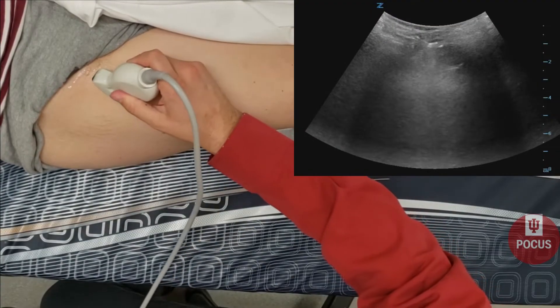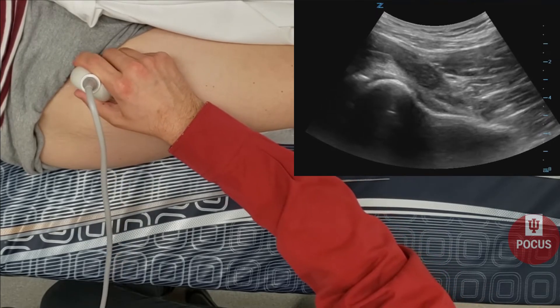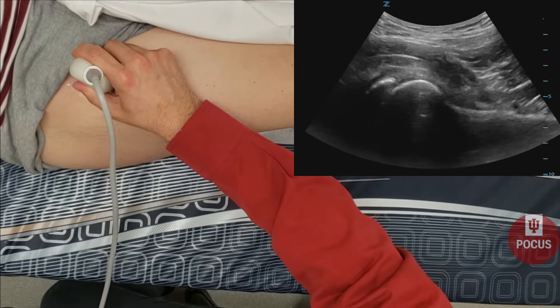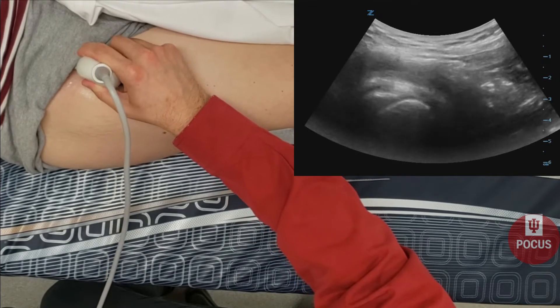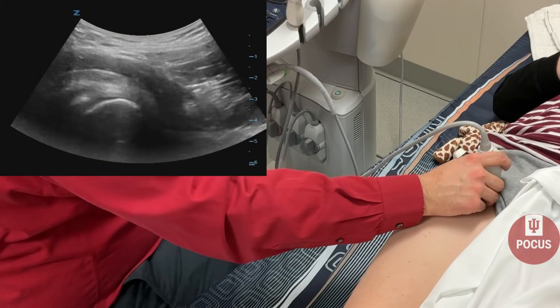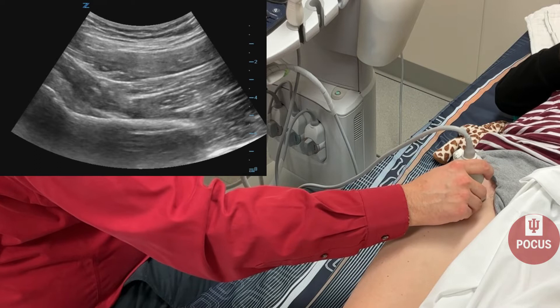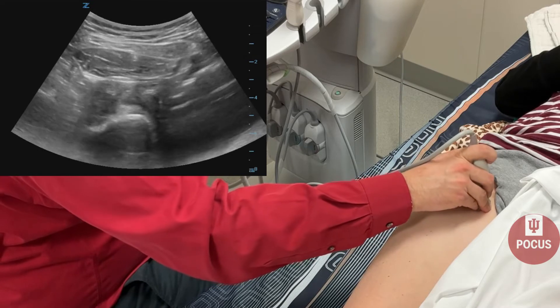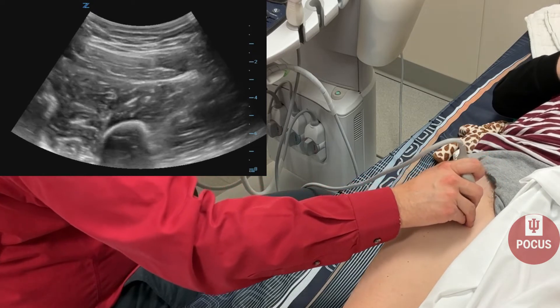We'll start with the anterior hip. The ultrasound is placed in an oblique fashion to get the femoral head and neck, and we are looking at the anterior joint line. We'll zoom in a bit here, looking for any effusion in that anterior recess. Next, we'll follow the femur down distally, adjusting the depth as needed, and turn transverse to check for any signs of cortical irregularities, fractures, or breaks on the femur.